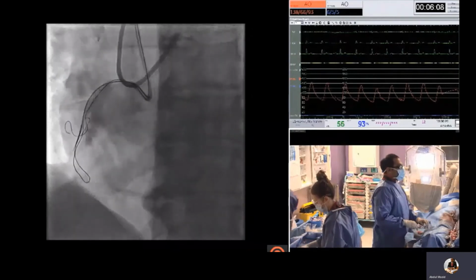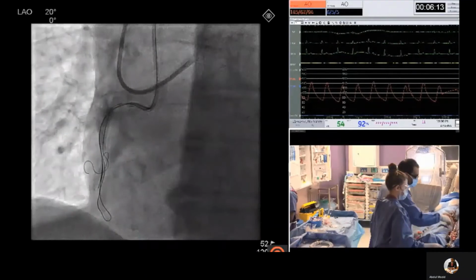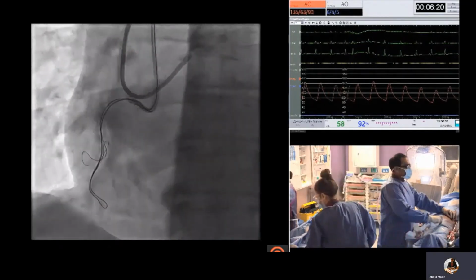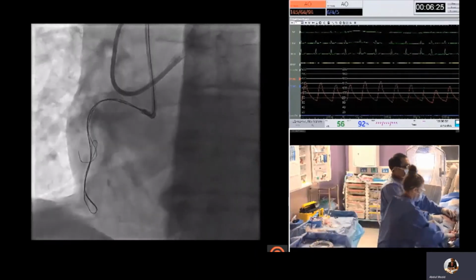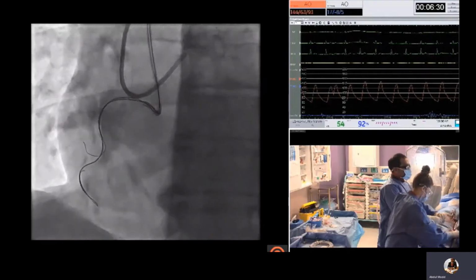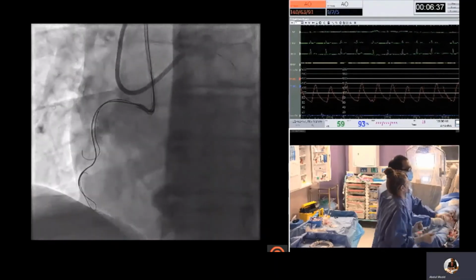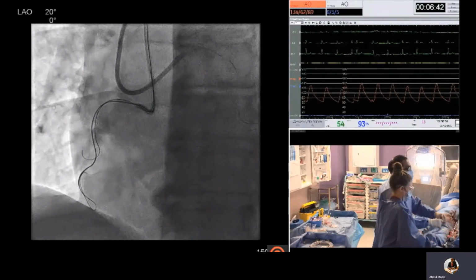So for fluoroscopy, the vessel is heavily calcified, so there did appear to be a spot of vessel at the distal end, proximal to the distal bifurcation, which was not as calcified, and this appeared to be the best landing zone for re-entry. So the plan was to try and get to that point rather than attempting re-entry higher in the vessel. So again the Turnpike Spiral is taken on, and again a Fielder XT knuckle. We're now in a good position.